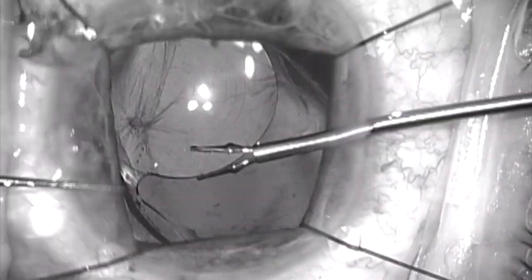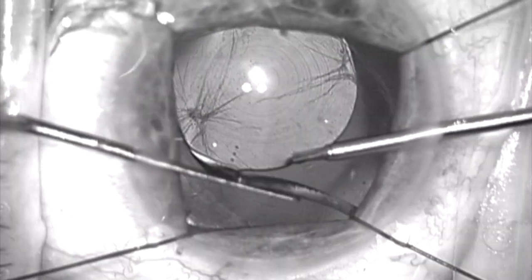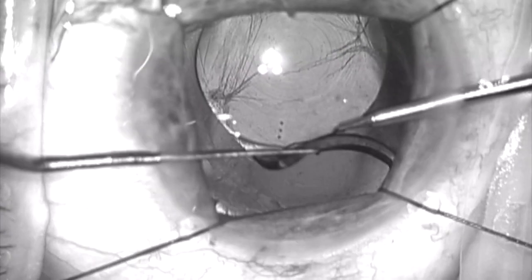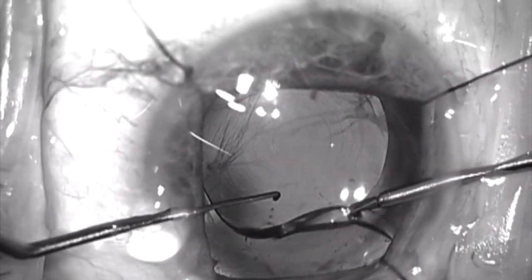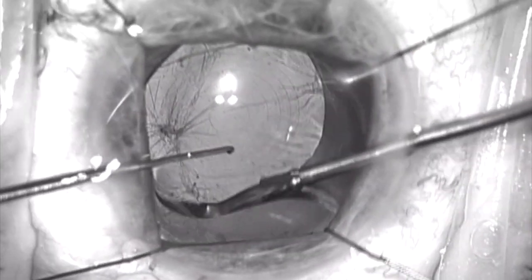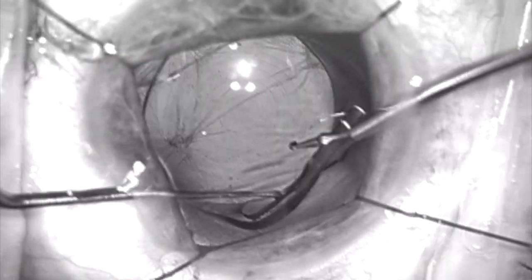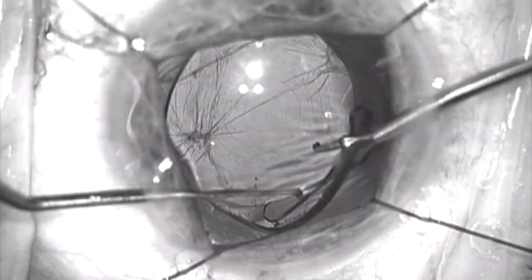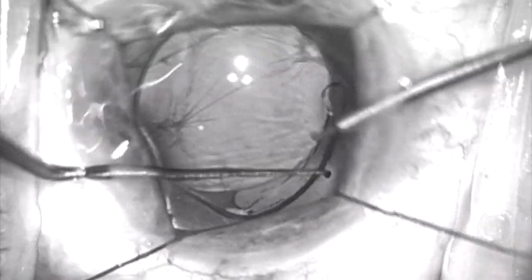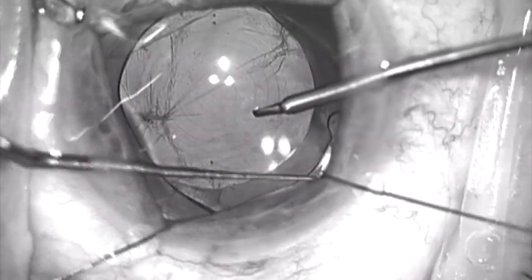Now I'm going to grab the haptic which is in the sulcus and find the tip of it, which I think has been irritating the iris from the back surface. And I'm going to try to place this under the anterior capsule rim that I've clearly identified at about 7 o'clock. We're going to now tuck this haptic in and under the anterior capsule rim.